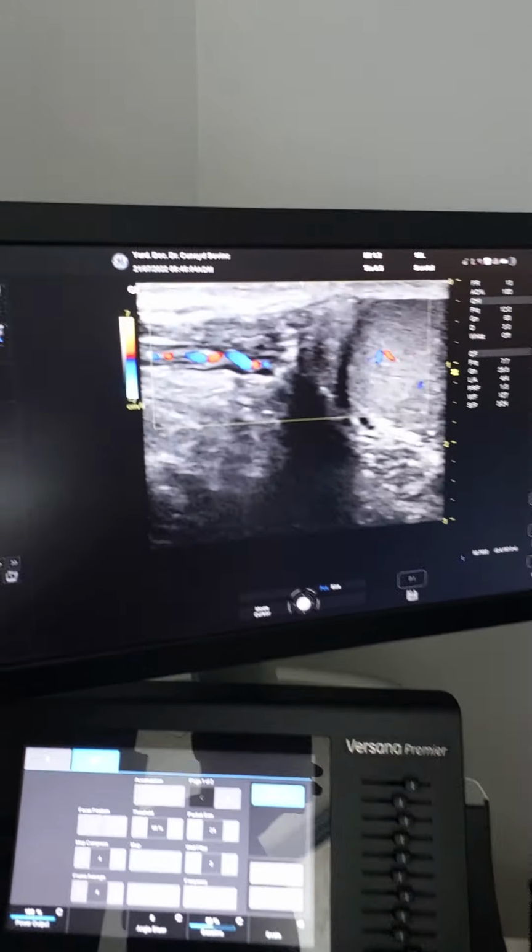Now, look. When he strains, we see for 1 or 2 seconds, look again, the veins. Then they disappear. This is a normal testicular blood supply, no varicocele in the right side.